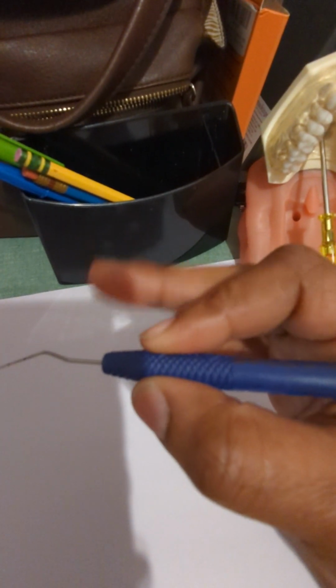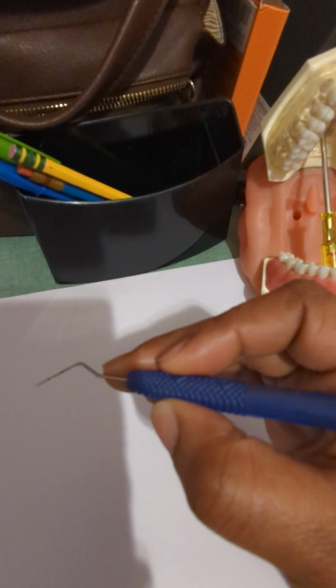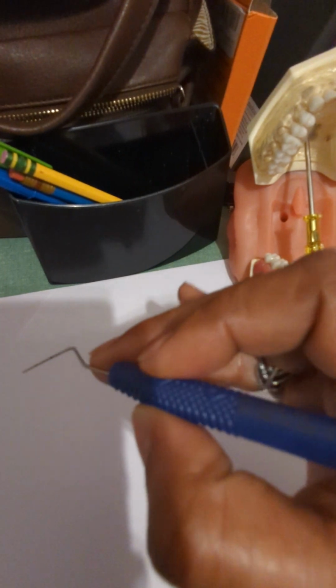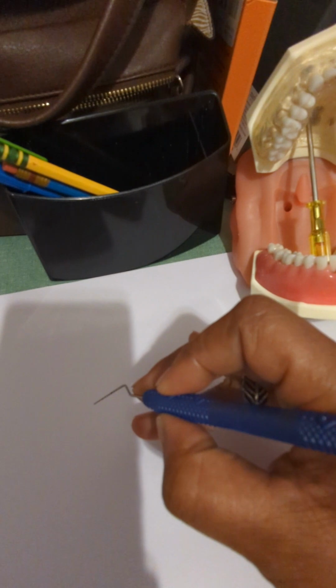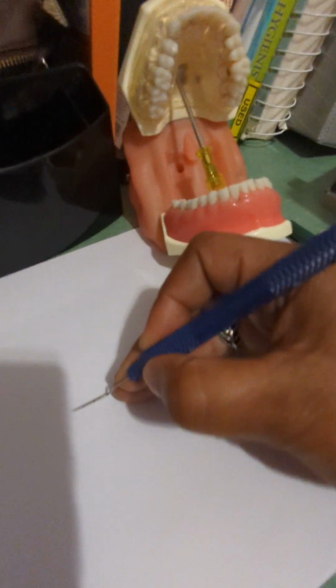Now you're going to take your middle finger and place it on the shank. Then your ring finger will be your fulcrum finger. So it will be placed like this, on most likely an occlusal or incisal part of the tooth. And they will collapse on top of each other like this.